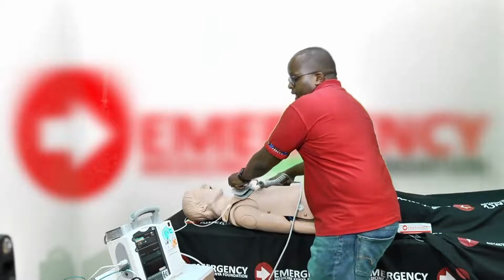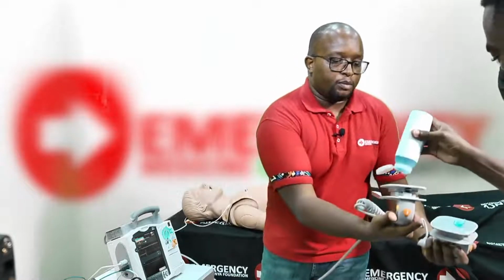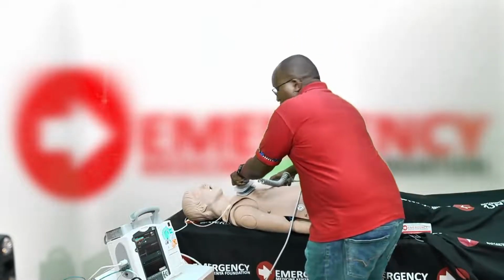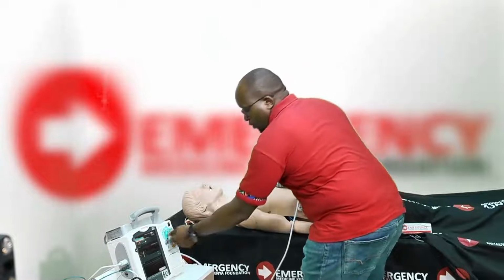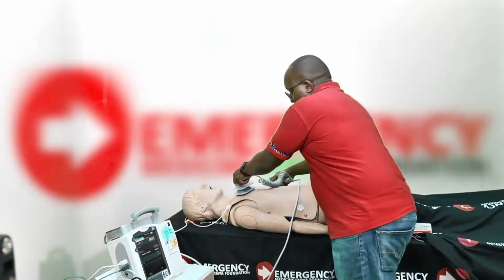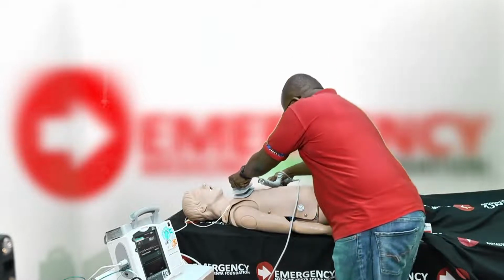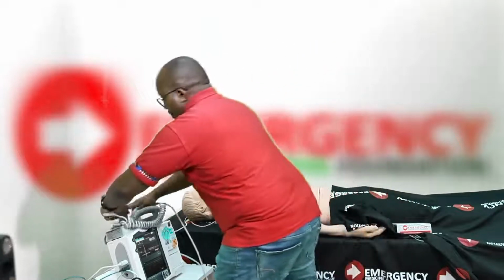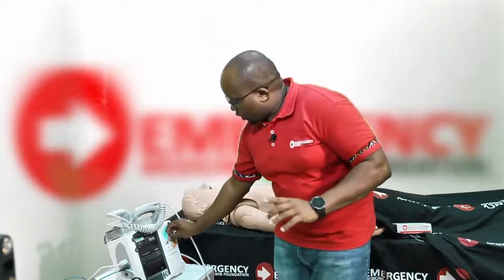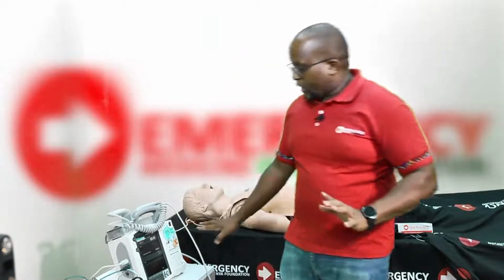So I'll ask my assistant to continue CPR. I'm going to put some gel, a blob and a blob, and I'm just going to rub a bit. I'm going to go to 150 joules as recommended. So blob, I'm going to charge. Fully charged, clear everyone. Shock, put them back, resume CPR. All right, so key things in that whole discussion. Normally you leave your monitor on where it was.